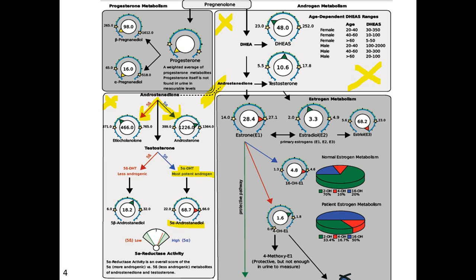And we really want to look for patients who really promote 5-alpha reductase. That's kind of what we're looking for in this section. So we've removed the actual measurement of 5-alpha DHT from the top right box, and we're listing that value still on page 1, but not listing it here.